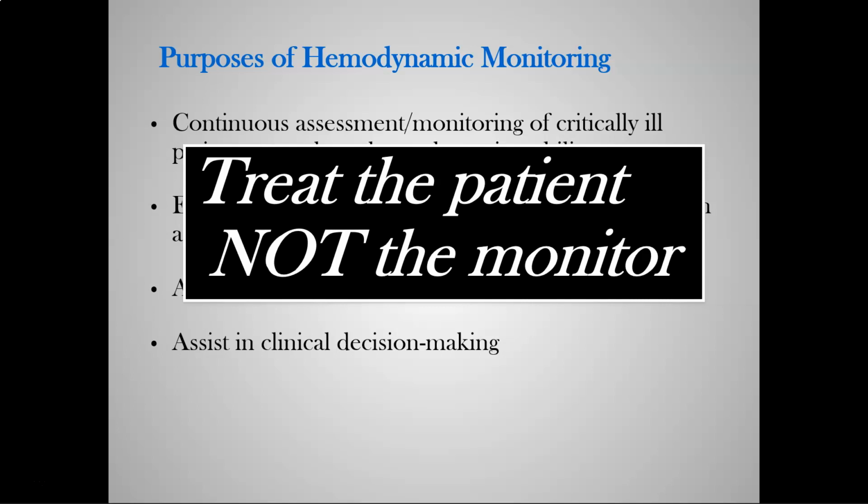It's easy to look at these numbers and these monitors, especially when they start making all these funky little noises and sounds, and you're sitting there staring at it and you're like, oh no, my patient's dying or is dead. Look at the patient, look at their state. Bradycardia is a perfect example, hypotension, perfect example. In otherwise healthy patients who exist in states of persistent bradycardia or hypotension, if they are asymptomatic, is that something that's really hurting them? That's a question you have to ask.